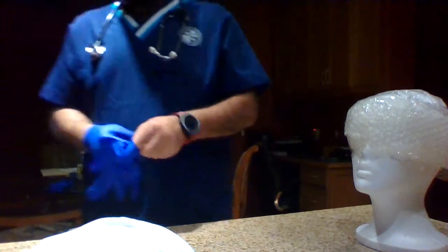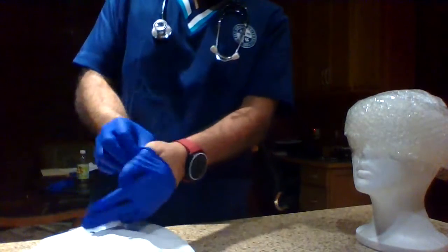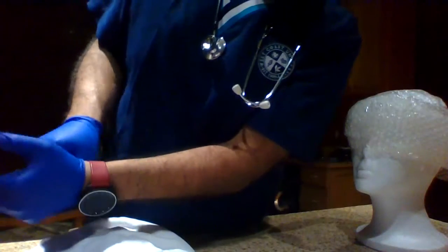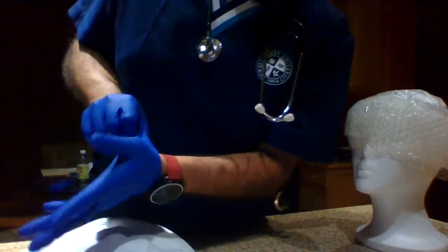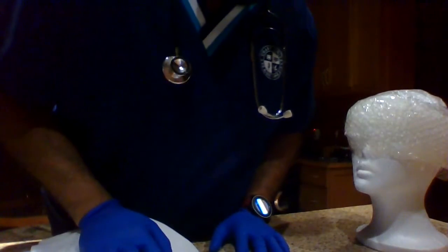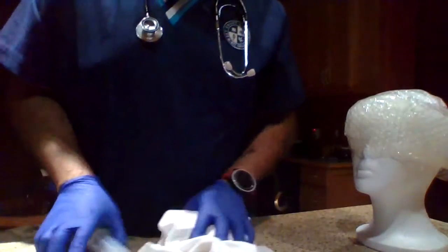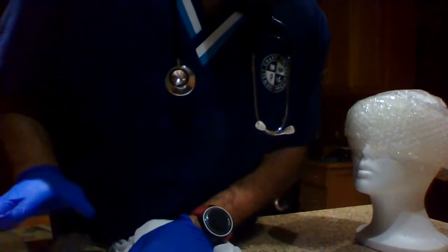Again, medium-sized gloves, not my size. This is all I have. So we have all of our supplies here. If suction is ordered, you have to verify the suction source type and the time. You have to connect the suction tubing and everything that's there. So we have gathered all of our supplies here for this actual procedure.